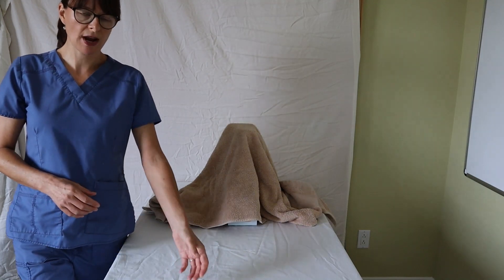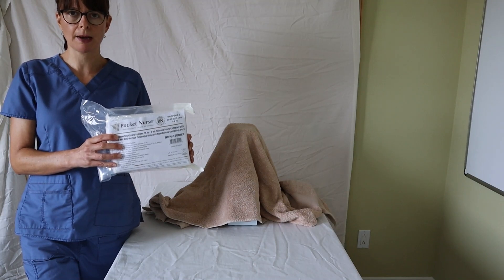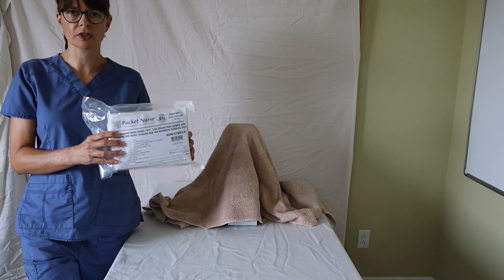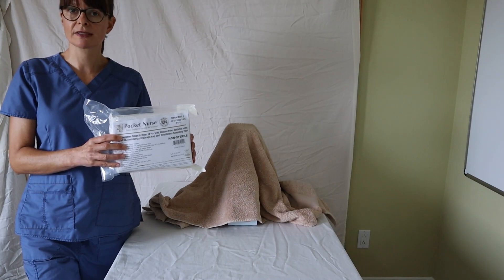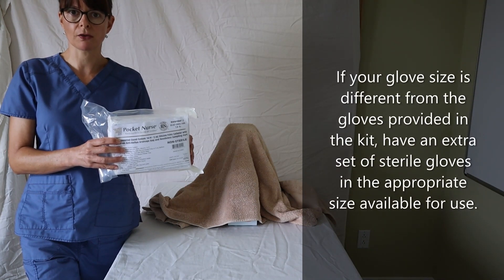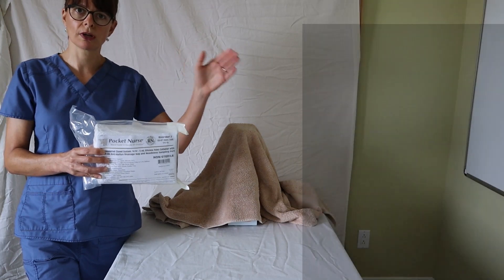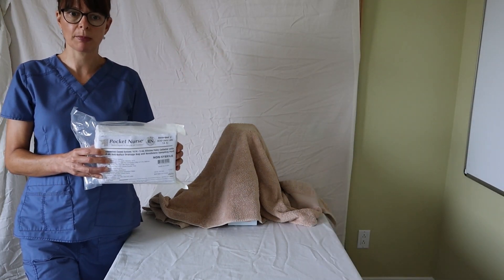I like to have a catheterization kit and maybe have a second kit as a backup just in case something happens with the sterile technique, or even have a second pair of sterile gloves available just in case you contaminate your sterile field, so that you're ready to go and don't have to leave the room and come back with those supplies.